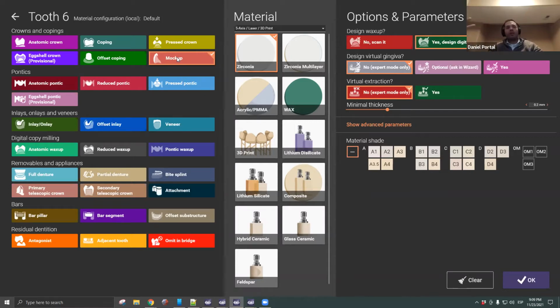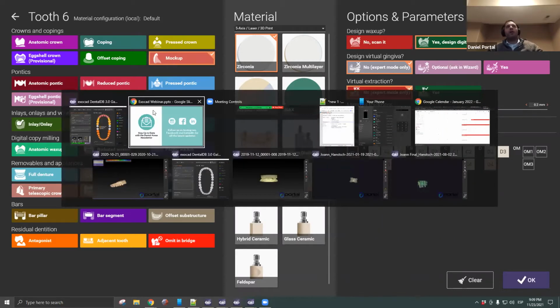And that gives me a finalized design that I can send to the doctor within 5 to 10 minutes after surgery is done, and it can be printed on immediate load, almost chairside. So it's a workflow that I've implemented with a lot of my clients, and so far it's given us really good results. So with that in mind, I would like to show you one of the ways that this is used quite often.